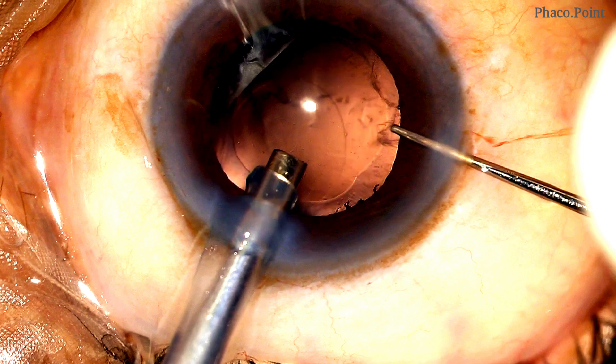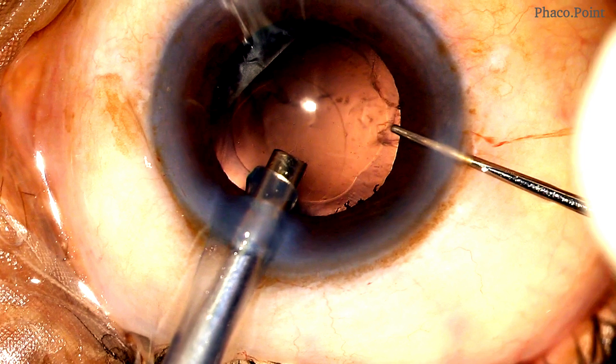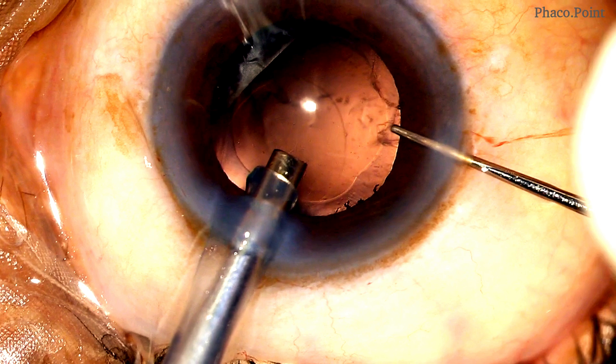Now, how do I manage the case hereafter? I have a tear in the posterior capsule and the phaco probe is in the eye with the irrigation on. So let's see what was done to prevent the PCR from extending and to prevent any vitreous loss.